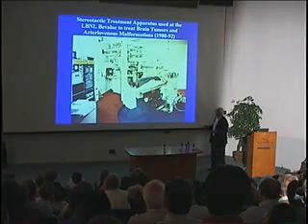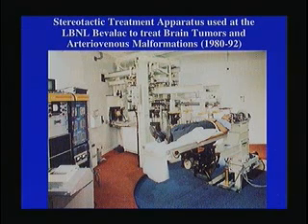So this is a setup, the patient on a bed, careful alignment done by one of our investigators, John Lyman, who would allow us to get millimeter precision on this air table, very precise, and it was an amazing job of accurate pointing.